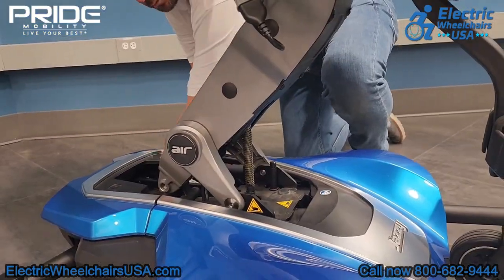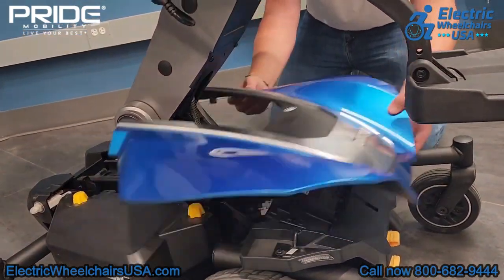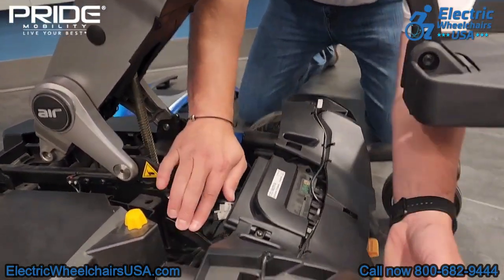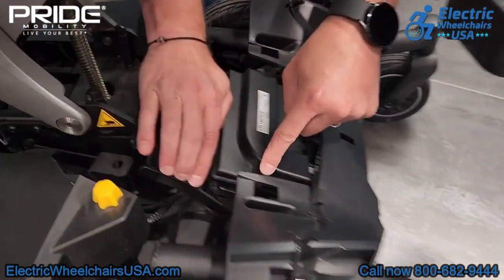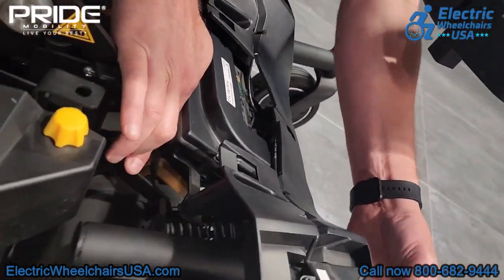The Jazzy Air 2 also has a suspension system. By removing the panels on the base of the chair, you can see the give that the front caster wheels have, which helps when going over bumpy terrain. You can see the spring suspension here — it's a really smooth ride for a mid-wheel drive power wheelchair, on top of being a power elevating seat wheelchair as well.